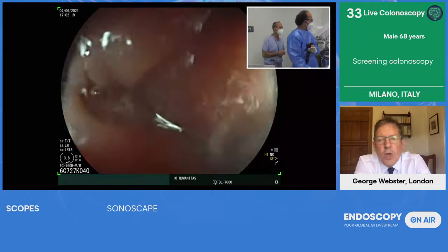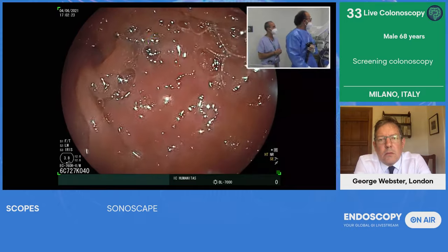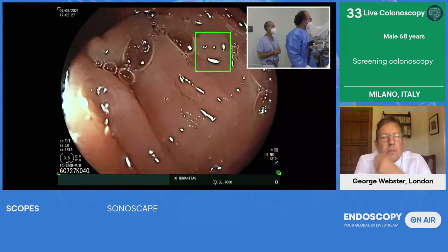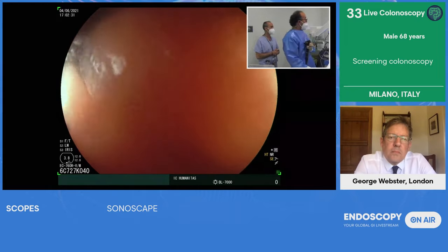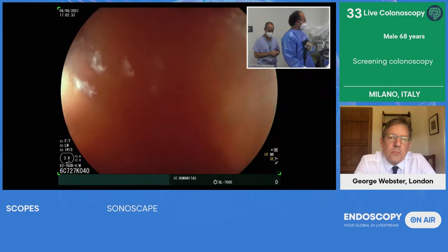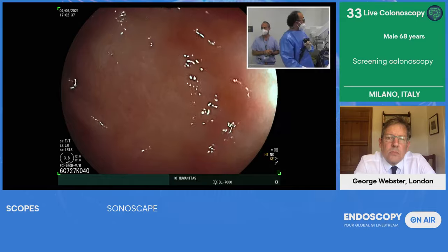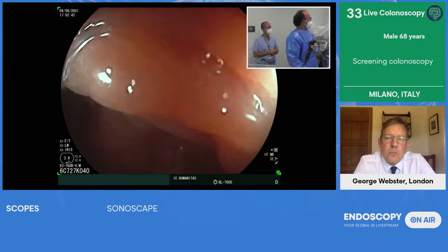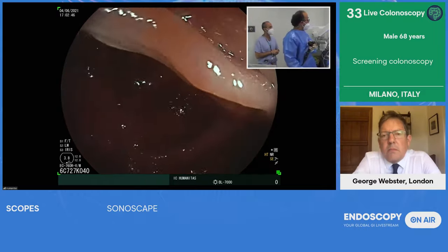So Cesare. Yes, Ale, we saw a second lesion. Now you may see this patient has a lot of spasm, but we cannot use Buscopan because he has ocular hypertension. Yeah, this is a third lesion that we anyway found. And this is thanks both to the balloon, I would say, and to GI Genius. Here is the lesion. So, congratulations, Cesare, for showing the system.